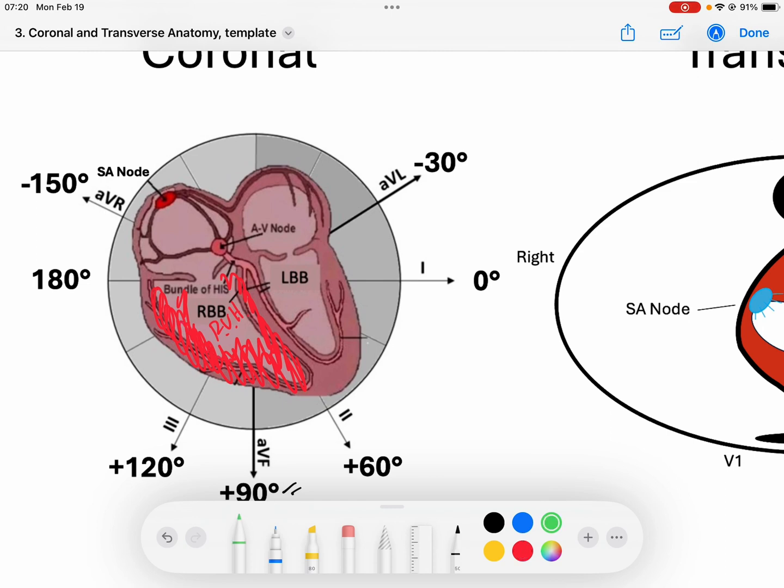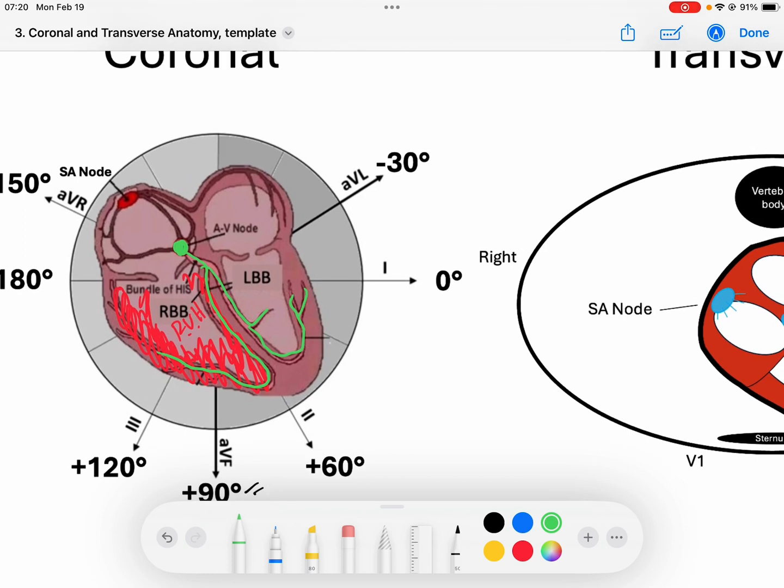Now when the AV node takes that signal and sends it down to His Purkinje system, we still have a functional His Purkinje system. But look what happens - we get forces that are starting to be drawn towards the right ventricle. We get an axis of depolarization that is starting to head towards the right ventricle versus the left.